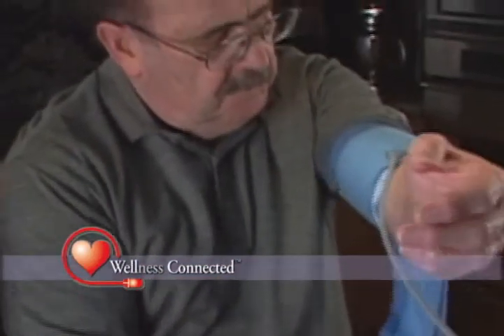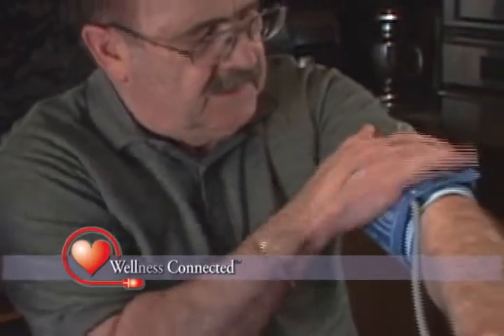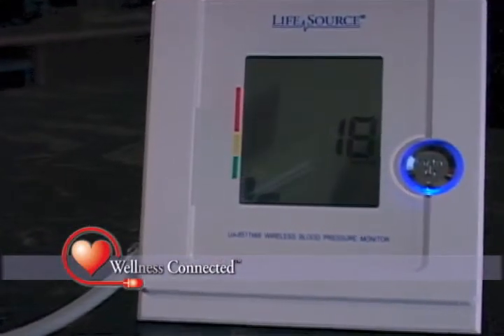To take your blood pressure, simply slide the cuff on and tighten it just above the elbow. Then sit comfortably and relax for just a moment. Push the start button and let the wireless blood pressure monitor do the rest. It's that easy.